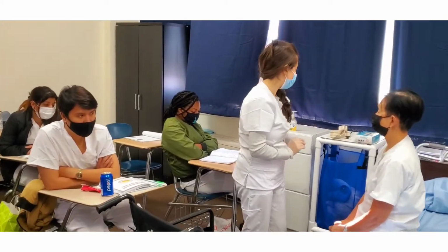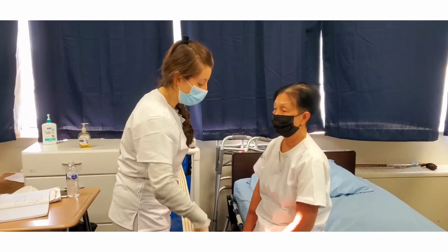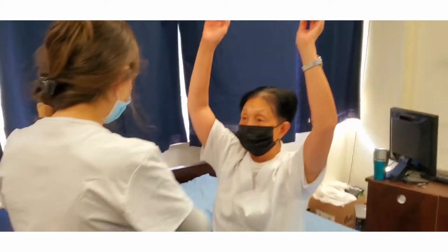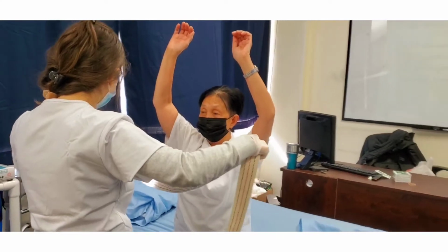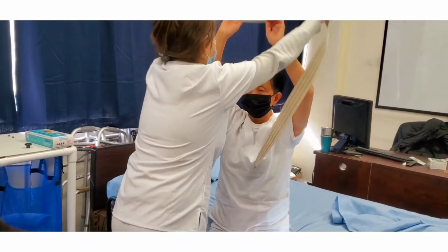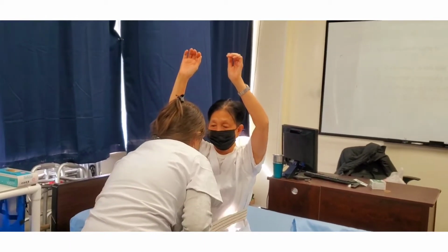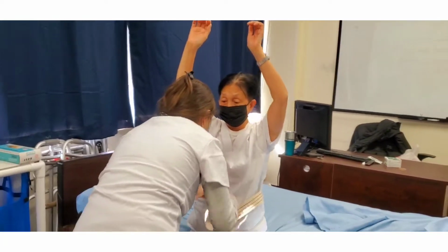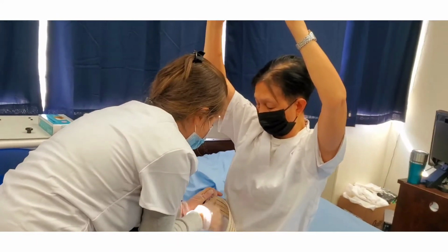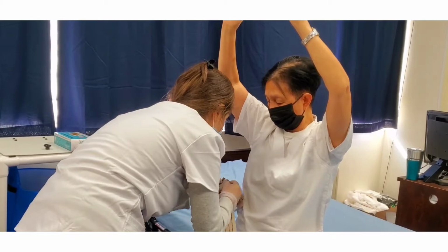Okay, great. So I'm going to ask you to sit still and keep your hands up. Thank you so much. I'm just going to put this belt around your waist to help you stand up. Make sure that when you close the belt, it is not on your belly button, but towards the side of the person's belly button, to not put any pressure.